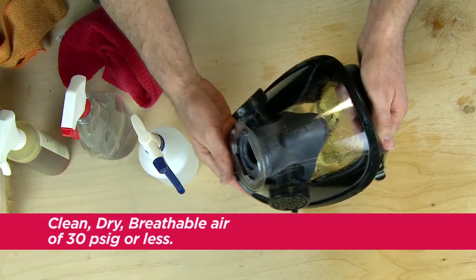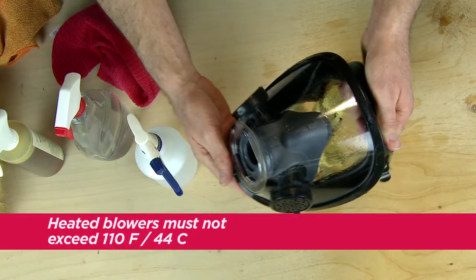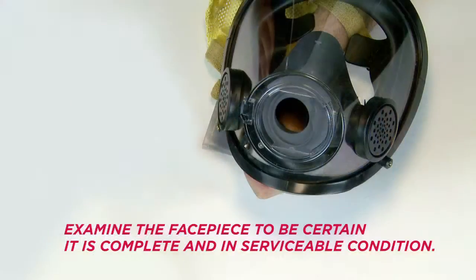Do not use shop air or any other air containing lubricants or moisture. Heated blowers must not exceed 110 degrees Fahrenheit or 44 degrees Celsius. Examine the facepiece to be certain it is complete and in serviceable condition.